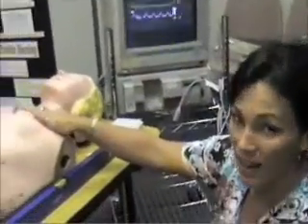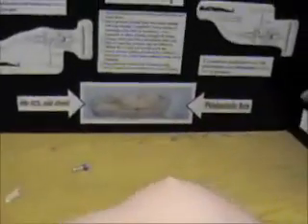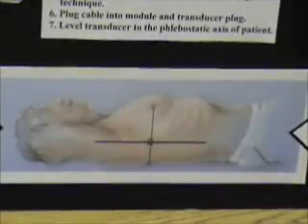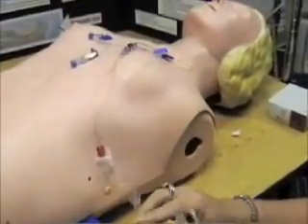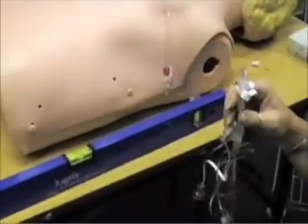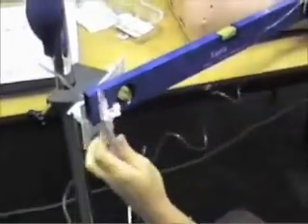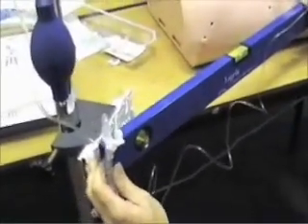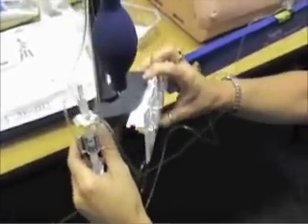To find the phlebostatic axis is where you want your transducer to be on the patient — it's the fourth intercostal space, mid-chest. We're going to take that spot on this patient and level our leveler to that spot. We want the transducer to be at the level of the phlebostatic axis, and the transducer is attached to the entire pressure tubing line that we just purged.